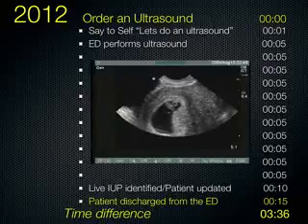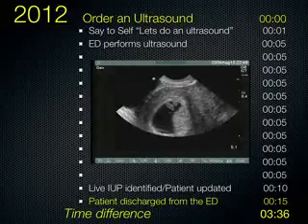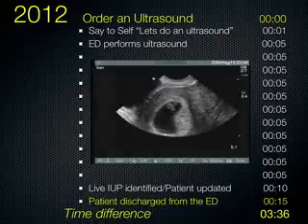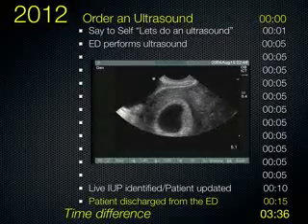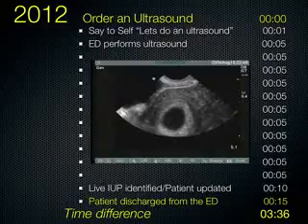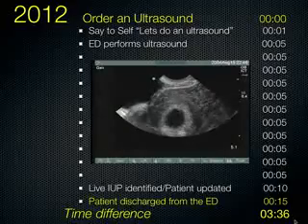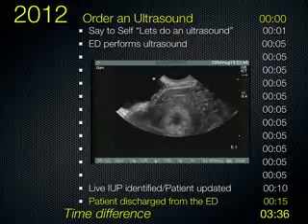About 3/4 to 80% of the time you see the signs of an intrauterine pregnancy, and you don't need to do much else except send the patient home. At least in my hospital, we have a very young patient population, so we see patients with complications of first trimester pregnancy at least 2 to 4 times a day. And when the beds start crunching, and we're holding all these patients waiting for admissions, and we're trying to turn over our few beds as fast as we can, this time difference becomes important when you multiply that several times a day.